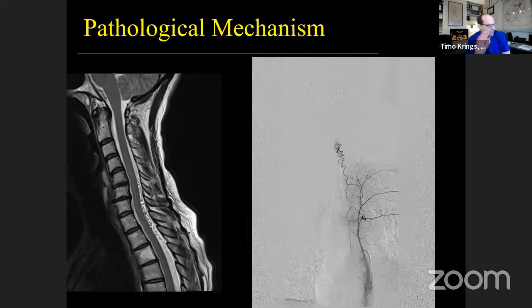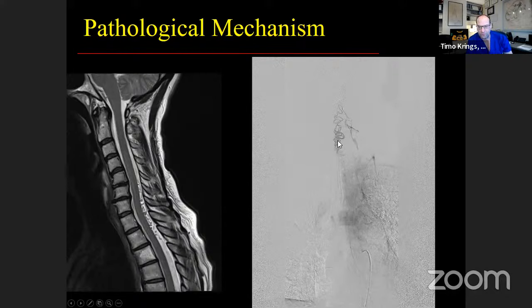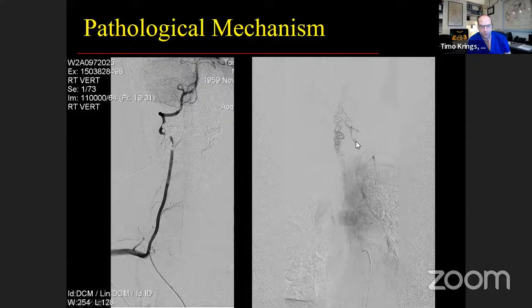And this patient intrigued us because clearly he has a spinal vascular malformation. But how come he's non-symptomatic? So when we looked at the angio, you can see that the patient has a classical dural arteriovenous fistula. Here's the draining vein, the very tortuous course reaching the cord surface here. But then what happens with the drainage is that relatively early on, it drains out into the plexus surrounding the cord and via radicular veins into the epidural and the hemiazygos system. And therefore, there is actually no congestion of this patient's cord because the venous hypertension is released very early on.